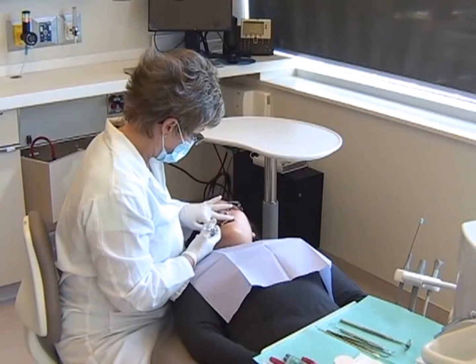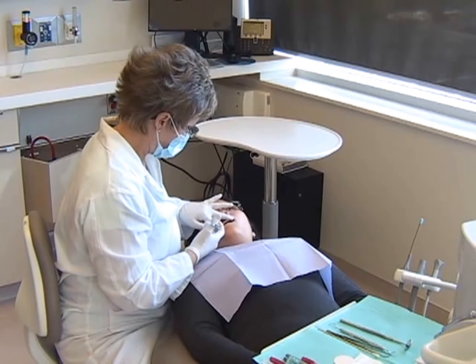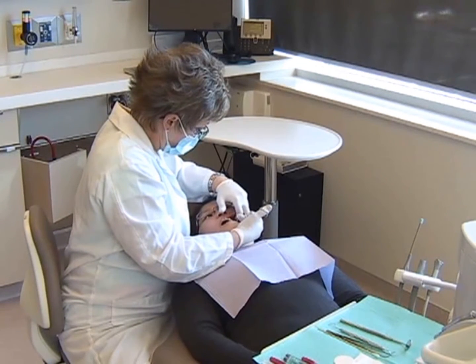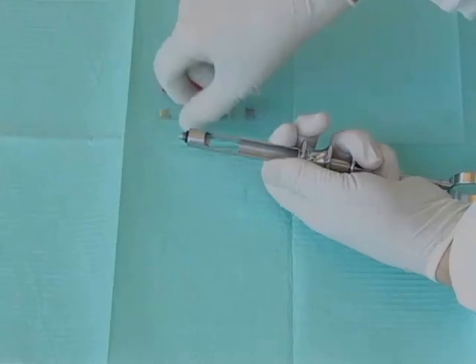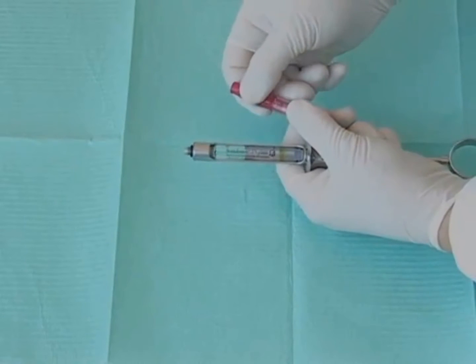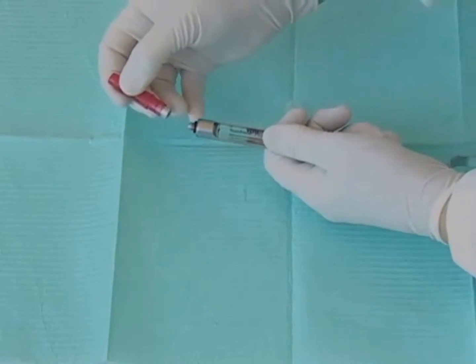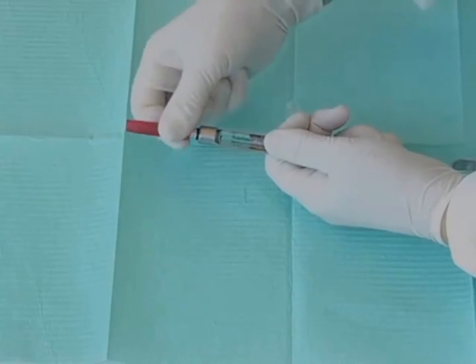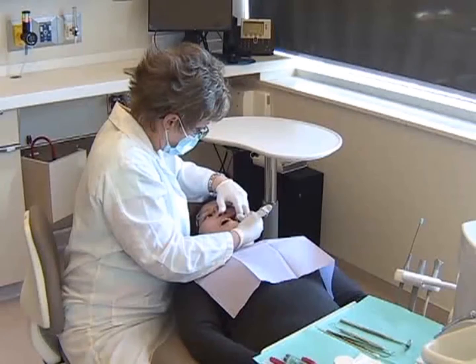The client is fully supine with the maxillary occlusal plane perpendicular to the floor. For the right PSA, the operator sits at a 9 o'clock position. For a left PSA, the operator sits at 9 o'clock with the client turning their head to the right side. Prepare the syringe with a 25-gauge short needle, orienting the bevel towards the bone. In the case of a right PSA, the bevel should be to the right, and for the left PSA, the bevel should be on the left.